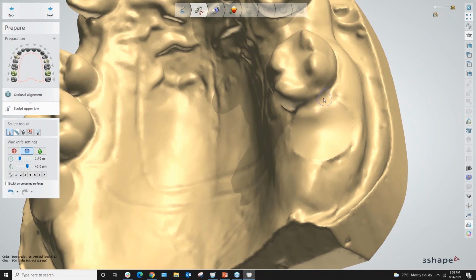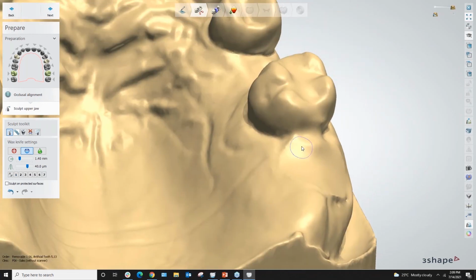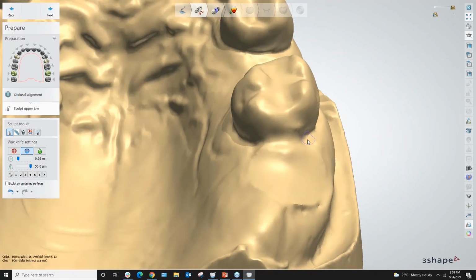Obviously, there's a lot of detail involved when you're doing these kinds of approaches, but I'm sure with the level of technicians we have that have joined us for this particular webinar, you will be doing an even better job than me as I'm demoing right here.